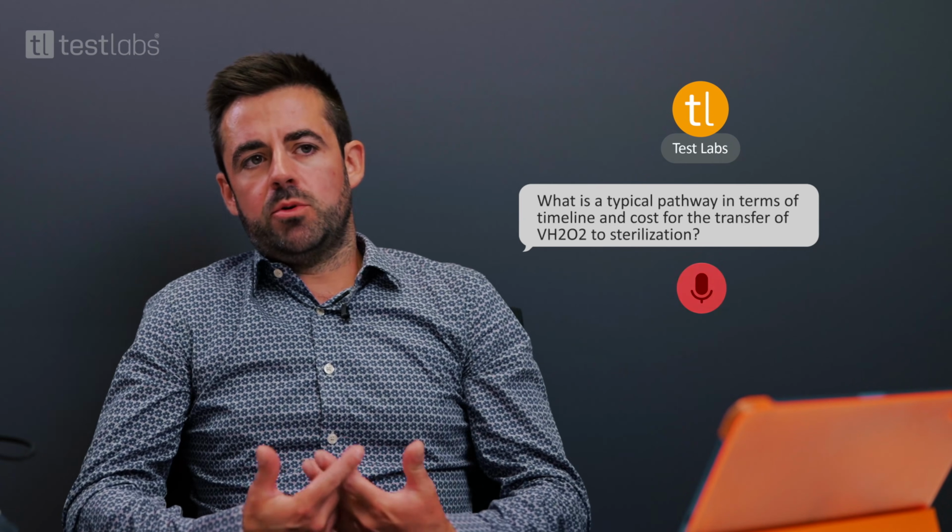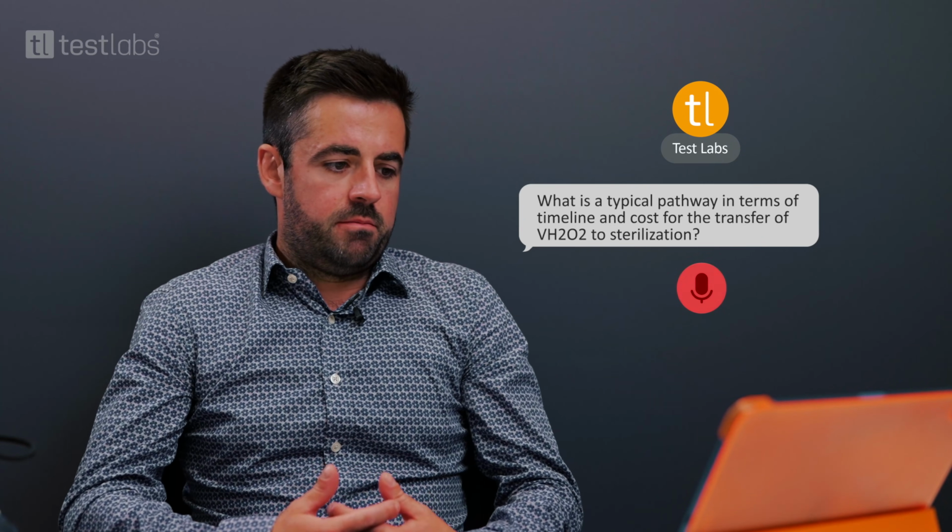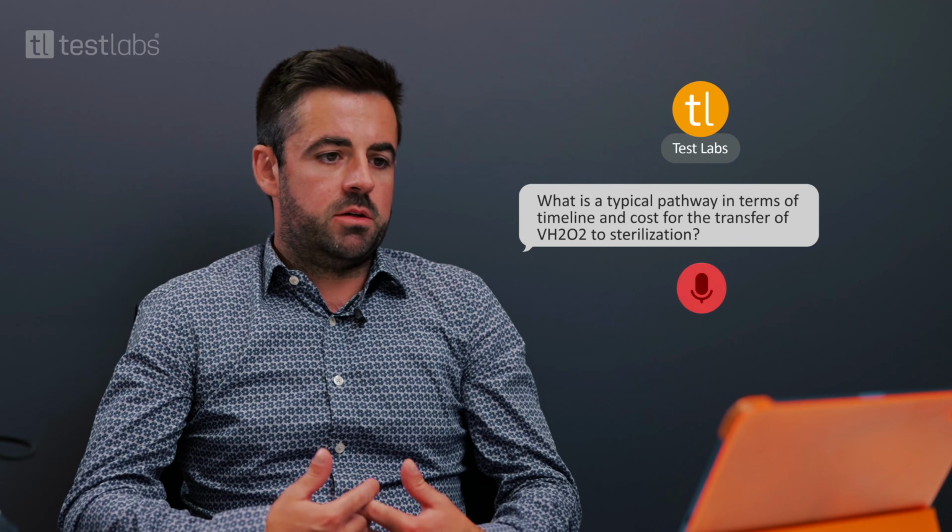So first we would look at your products. What are the materials? What is the packaging? Does it keep its function after a basic sterilization cycle, even without adaptation, without efficacy proven? And we will identify, among all the products you want to sterilize with VH2O2, what would be the most challenging candidates. We usually can sterilize among a product family. We usually pick the most challenging one, and then we don't have to validate all of them.